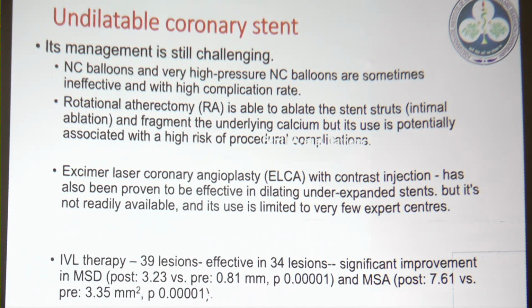Something about the undilatable coronary stent. Its management is challenging. NC balloons and very high pressure NC balloons are sometimes ineffective, with a high complication rate. You have rotational atherectomy. Sorry, my slide doesn't show the references because of some modification in the slide, and therefore I am not able to quote the various references which I have mentioned across this statement.